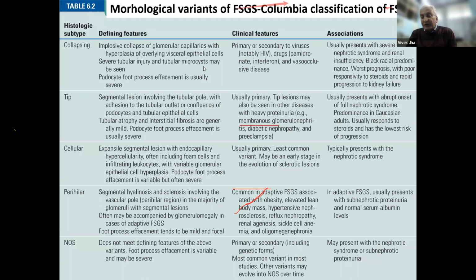Thank you. Just one more question. Can you give all of us some tips on how to differentiate primary from secondary FSGS on examination of the biopsy tissue? Dr. Both you and Dr. Aravind did point out that hilar lesions may indicate that, but are there any other tricks both for light microscopy, immunofluorescence, and electron microscopy to make that distinction?